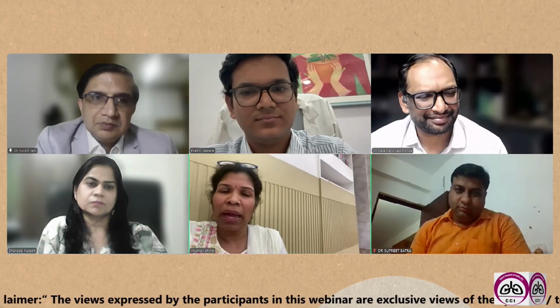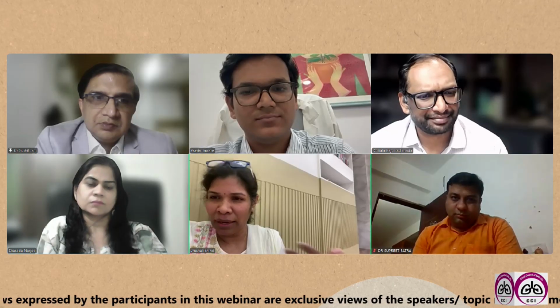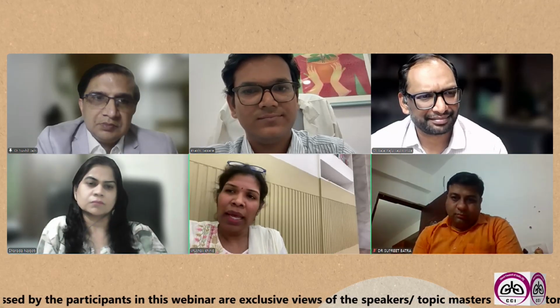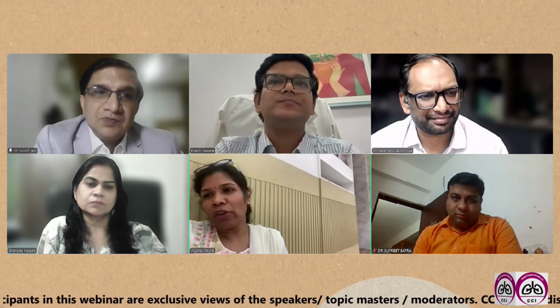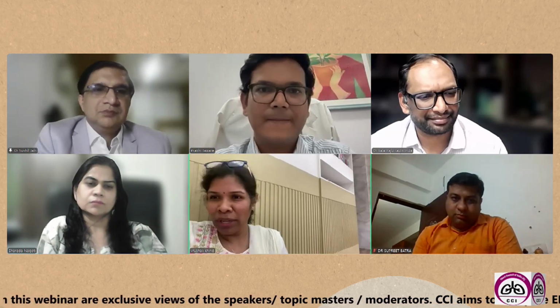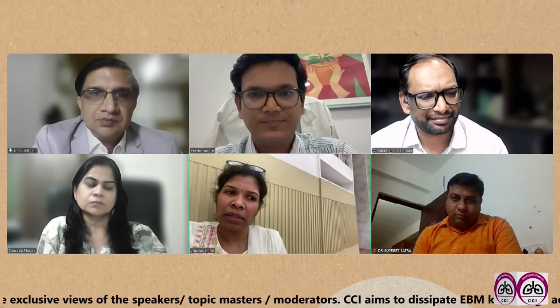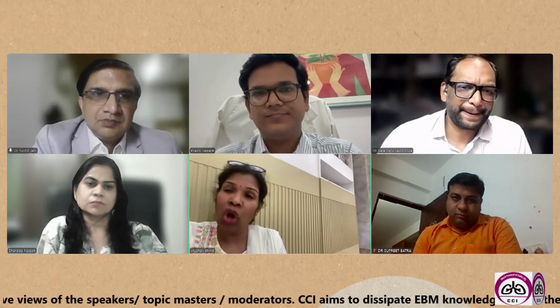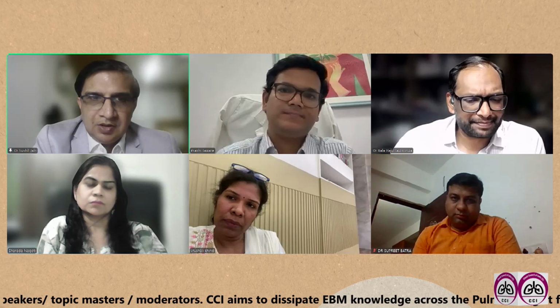So particularly from my end, if you follow whatever has been told in the first three lectures by you all, I wouldn't really like to change anything. Having a ROSE gives me confidence, as I have said even in the beginning, and I think take as much sample as possible, not on the slides, but in either the formalin or the NS.